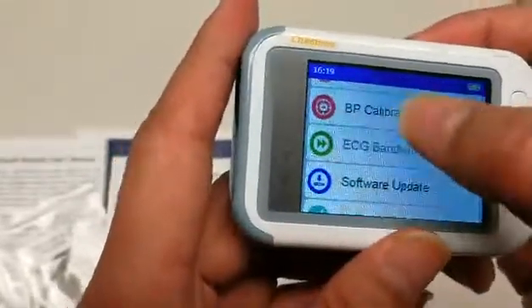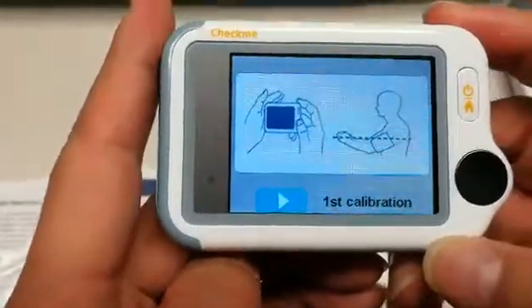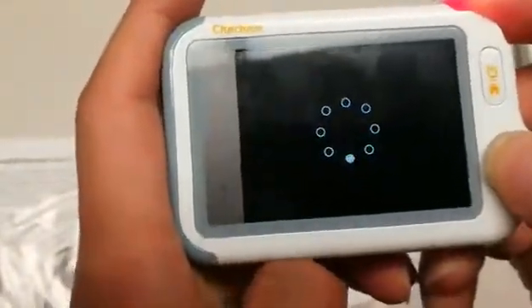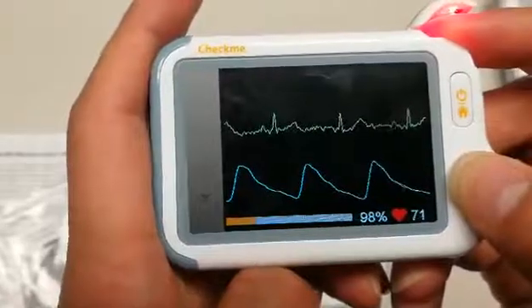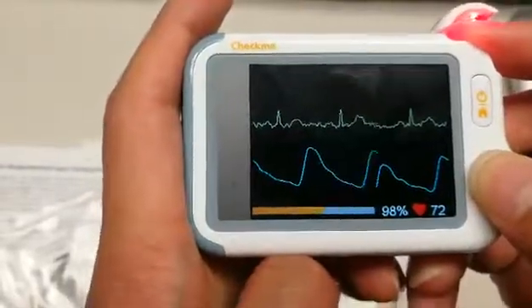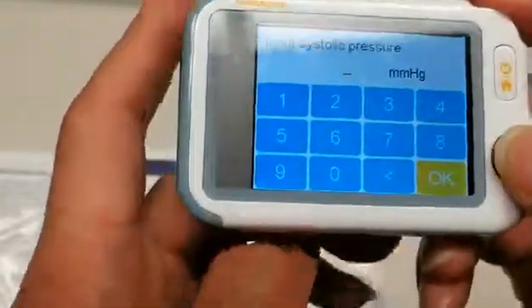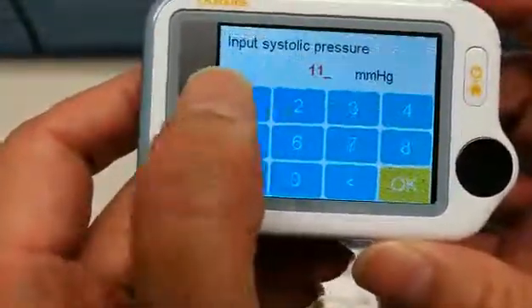To calibrate your blood pressure, please go into the settings and then blood pressure, which will give you a directional pad on your first calibration method. Measure blood pressure in your left upper arm, then take a daily check. You will then be prompted to input your systolic pressure, which can be found from the number on your regular blood pressure reading.